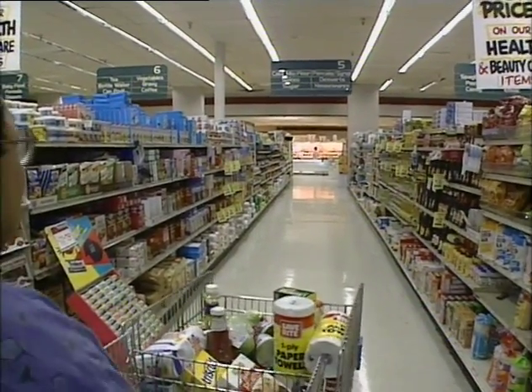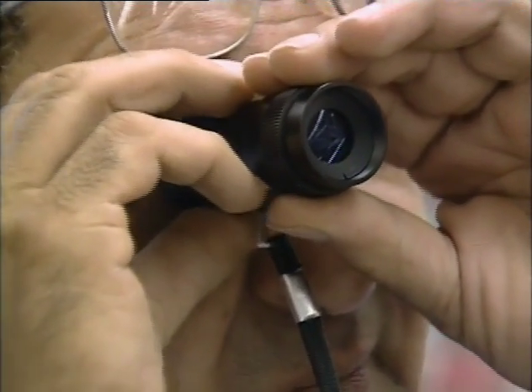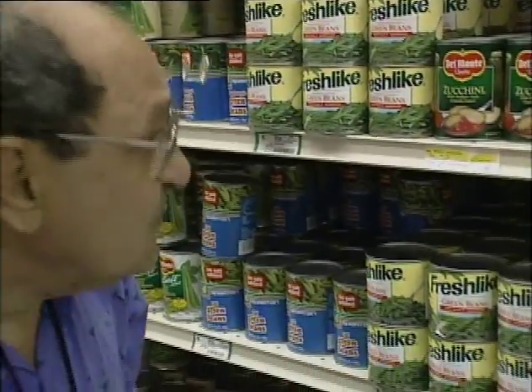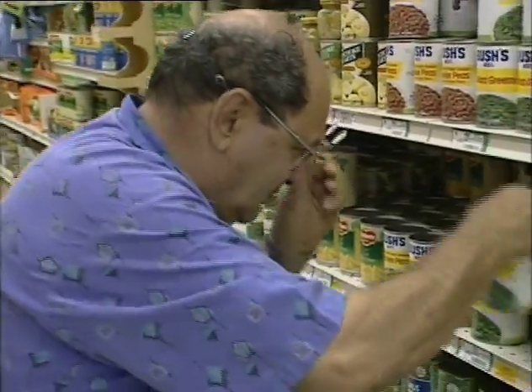Like many victims of macular degeneration, as it's called, Leonard uses a series of simple devices to help him cope. For long distance, a small telescope magnifies the letters of a sign so that they're legible just using his peripheral vision. He has to scan along the letters to read the word. For close-up, he has to choose a magnifying glass. The result is similar.